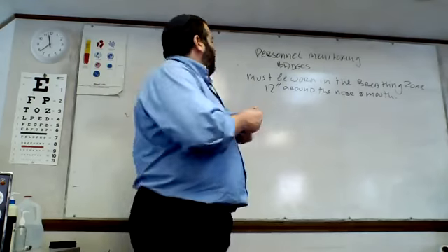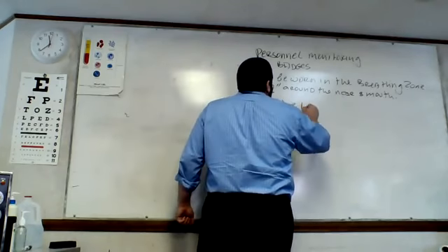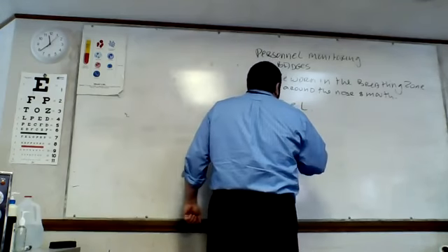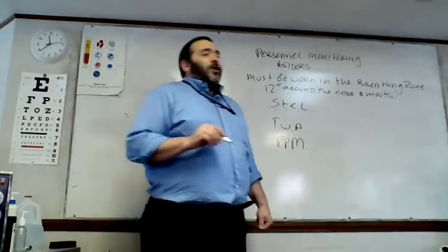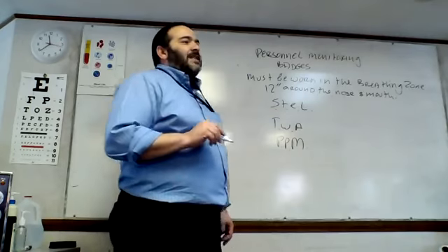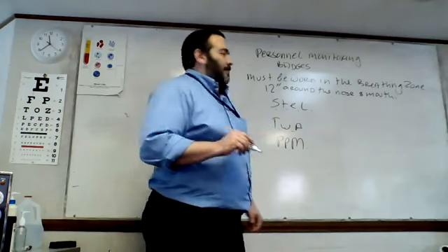Okay, so after that, I told you that we're going to deal with some things called STEL, TWA and PPM. First things first, what does STEL stand for? It stands for Short-Term Exposure Limit.